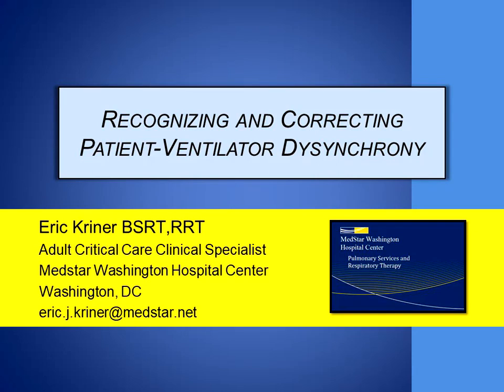That is a whole other presentation, how to recognize and correct this asynchrony in pressure-limited ventilation. So I didn't go there in this, but definitely a viable alternative, as is the volume-targeted modes. However, the same issue would happen in them. It's not just the change in mode that fixes the patient. It is allowing for adequate inspiratory flow.